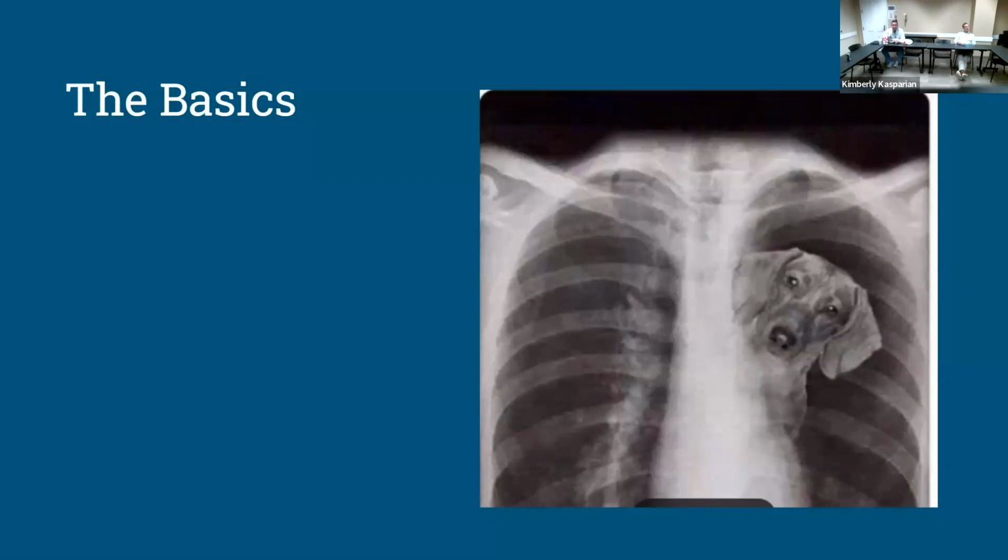So, all right, the basics. Anytime you read a chest X-ray, do it the same way, whether you use the ABCD method or whatever method you use. And two, chest X-rays are kind of like EKGs, where the quantity of how many you look at is just as important as the quality of your read. So anytime you admit somebody, I always recommend you look at your chest X-ray and interpret it yourself. Only because if you see 100 that are normal, when you see one that's abnormal, it immediately will click in your mind, that's not right.